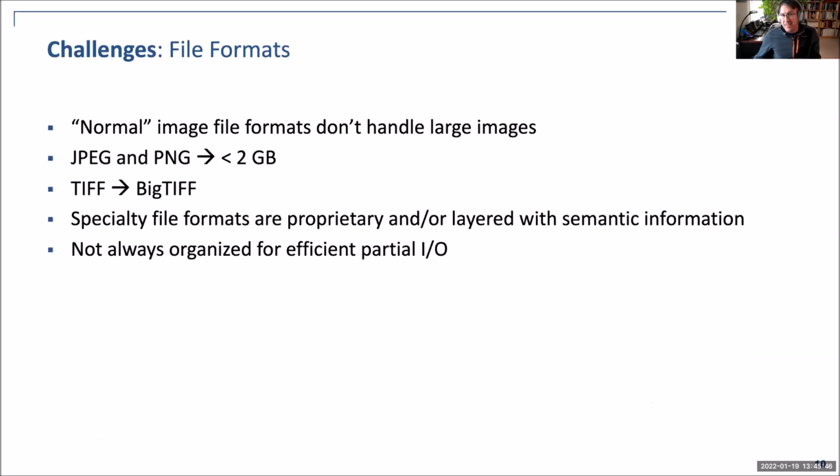File format authors generally haven't thought about large data. Russ mentioned FITS. It's a format that I helped support in the past, and it was definitely not made for very large data. A lot of these APIs were designed in the 70s and 80s when this simply wasn't a concern. Modern microscopy formats do take large imagery into account, but they're often hard to work with. Many of them are proprietary as well.